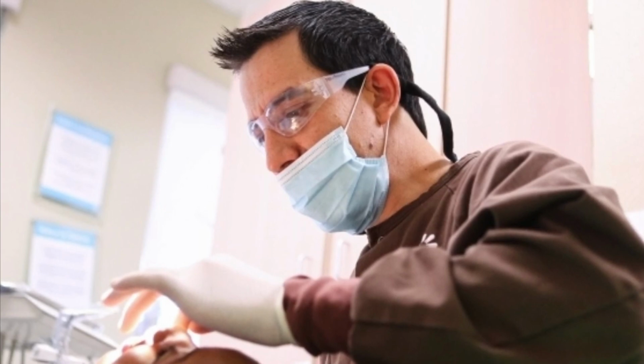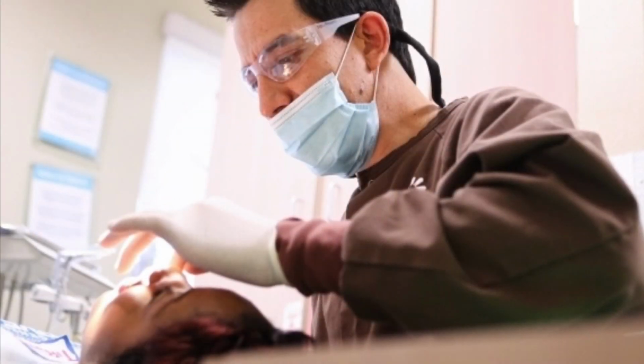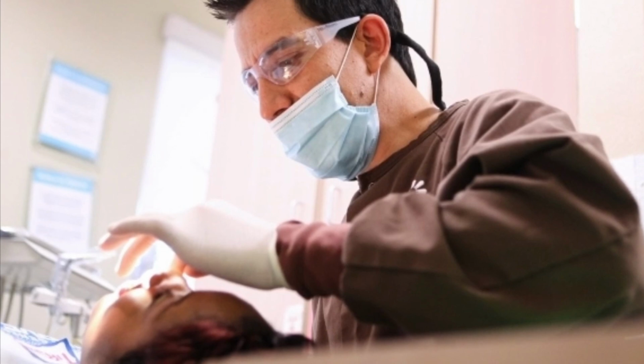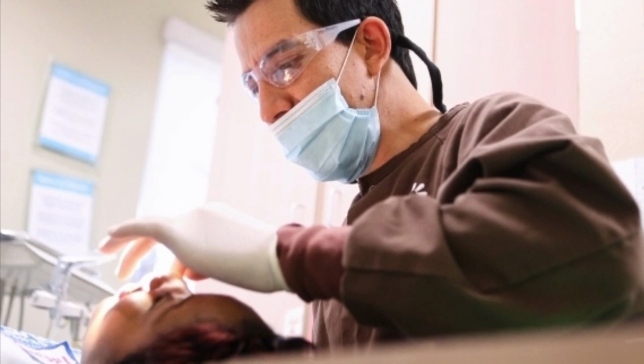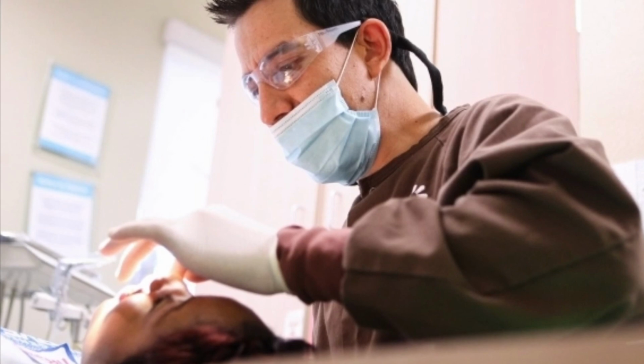Again, filing action is a push-pull action without rotation, with greater efficiency with files than reamers. The cross-sectional appearance of the prepared root canal is irregular with a general oval configuration, so the canal must be filled with gutta percha anyways. The cross-sectional appearance of the prepared canal is irregular because of the oval configuration with the filing action.